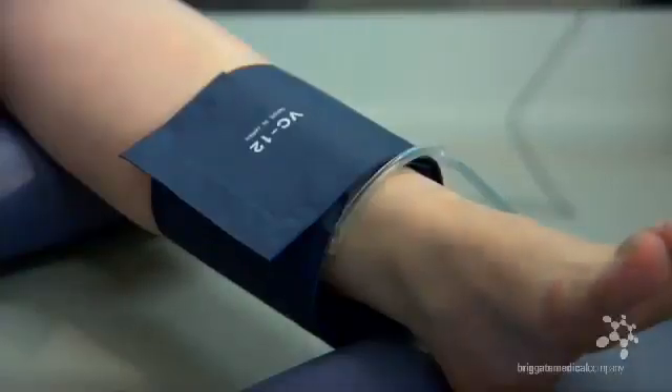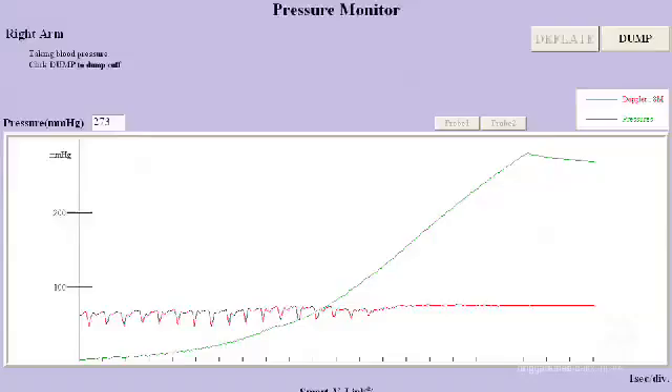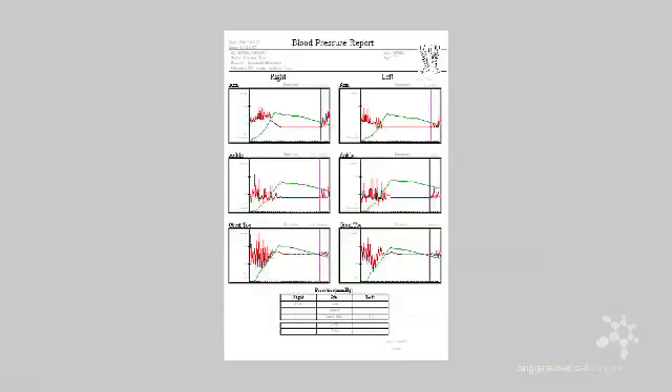Ensure that the weight of the patient's leg is not on the cuff. Once an ankle pressure is obtained and stored, an ABI figure is automatically calculated and presented to us as shown.